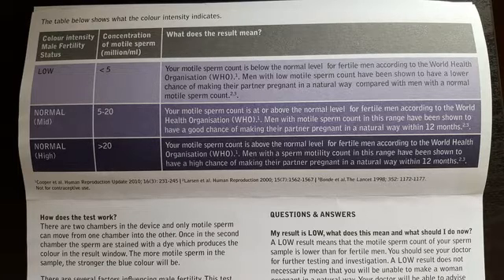If the colour result is similar to the lightest purple on the kit, that means the motile sperm concentration is below the normal level and is less than 5 million per ml. If the colour result is similar to the mid purple colour, then your motile sperm count is at or above the normal level of between 5 and 20 million per ml. If the colour result is similar to the darkest shade, then your motile sperm count is above the normal level at over 20 million per ml.